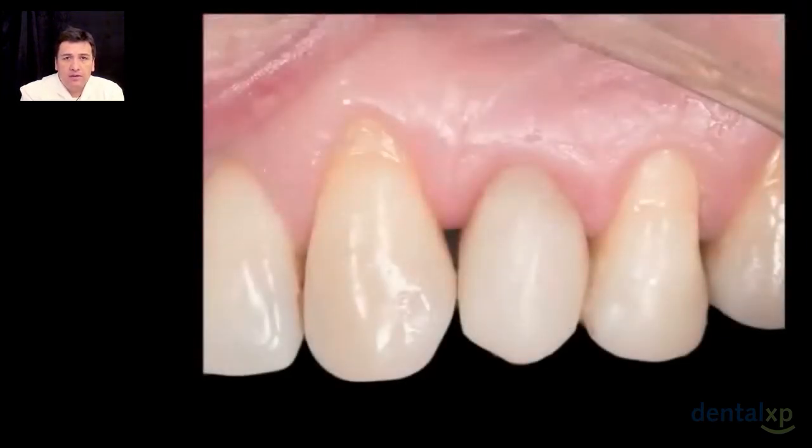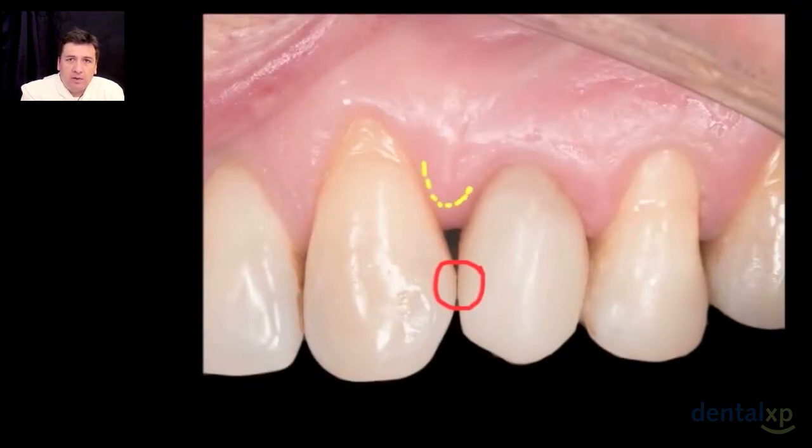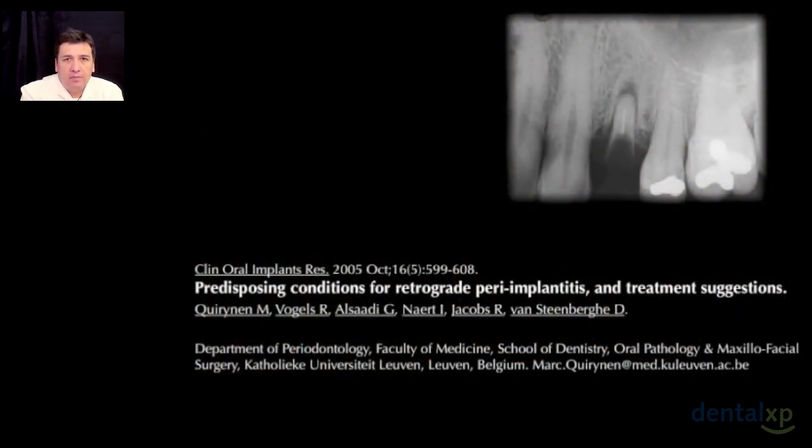After 1 month, as you can see here, there is in the mesial papilla a little black triangle that we may correct in the future with the correct crown anatomy and of course with the correct implant installation. We have to be very careful with the distance of the contact point to the bone, as the papers of Dr. Tarnow say, in the classic paper of 1992 and in 2001, with the implant relation and the tooth beside it.